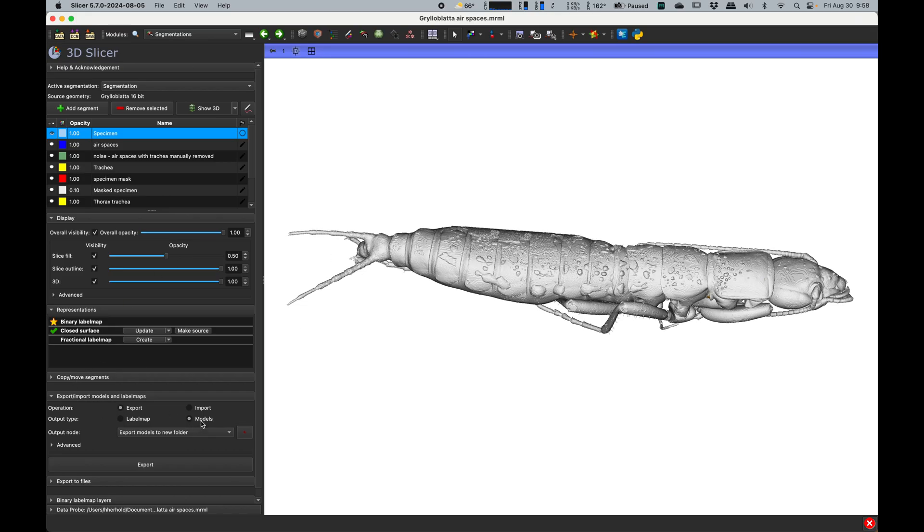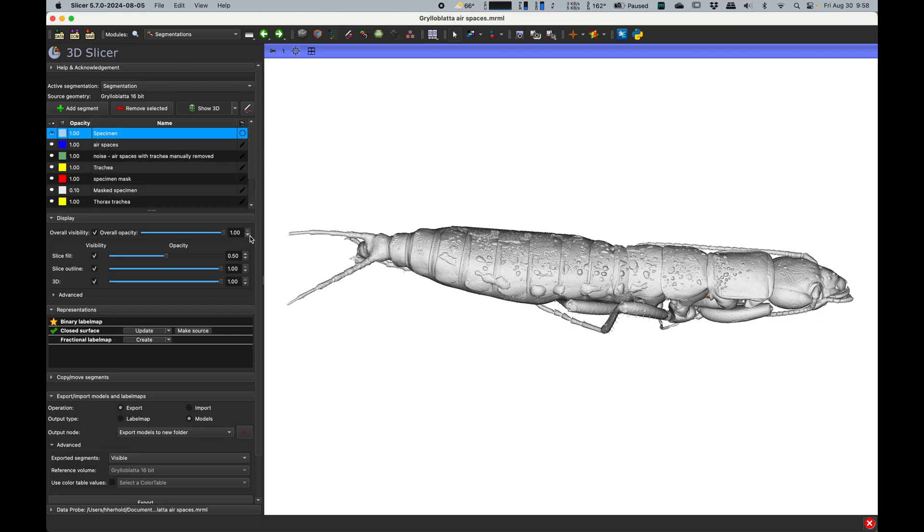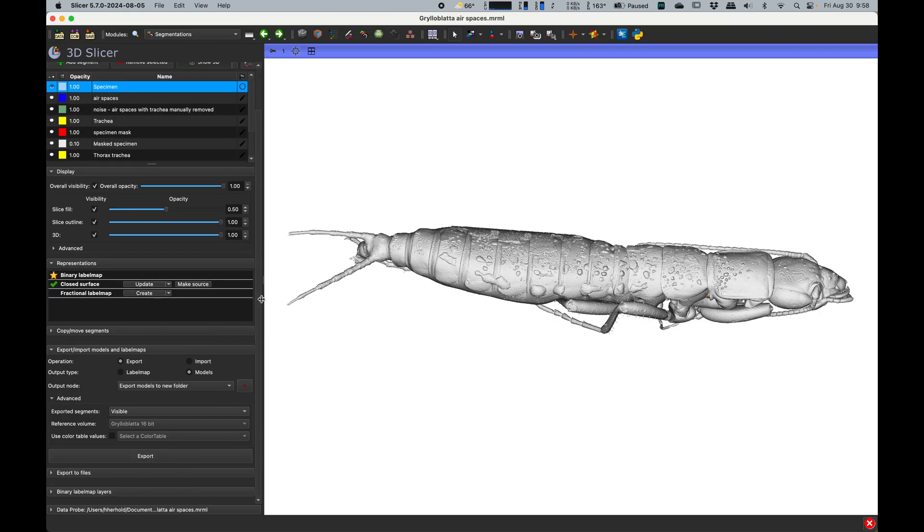Then I go to export models or label maps. I pick models, I want to put them in a new folder, and I want to do only the visible ones. Otherwise it'll do everything, which is not what I want in this instance. There's a lot of different things here and I only want these two, and then you click export. It takes a second and boom, it's done.